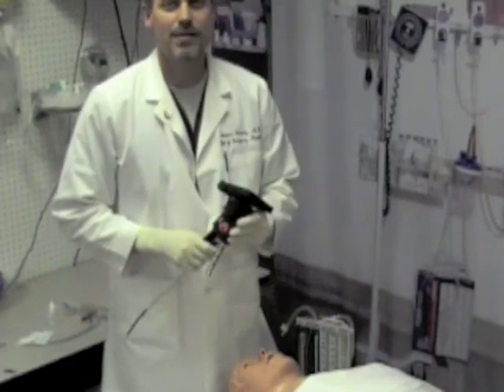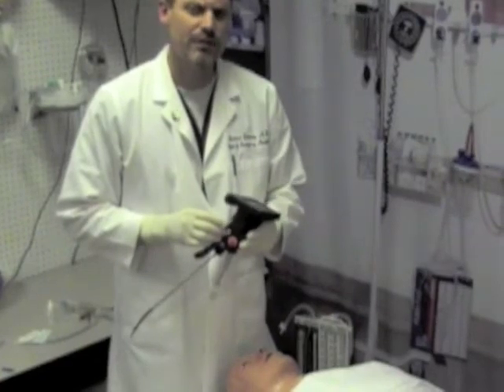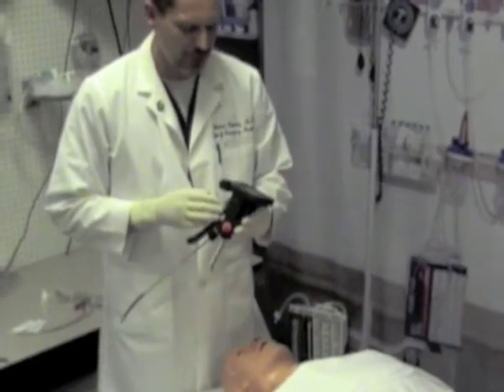Hi, I'm Richard Schwartz, the president of AI Medical Devices. This is going to be a brief educational video demonstrating the use of the Video Rifle.